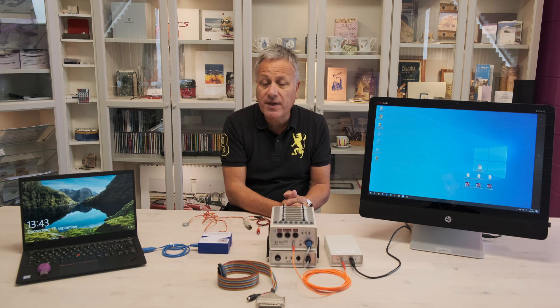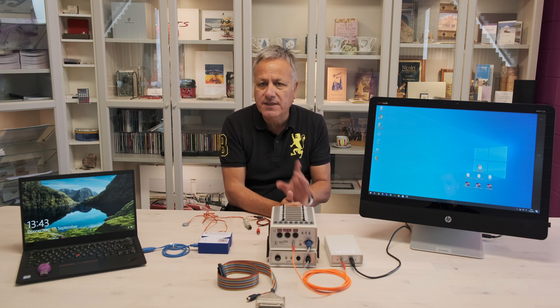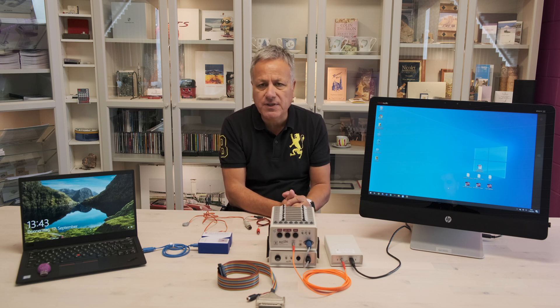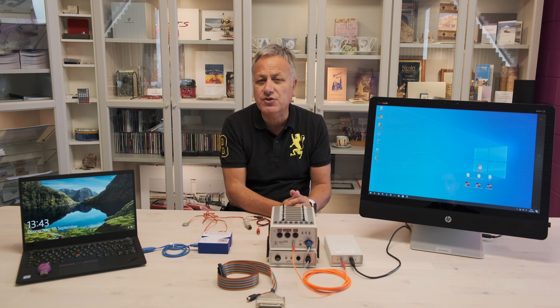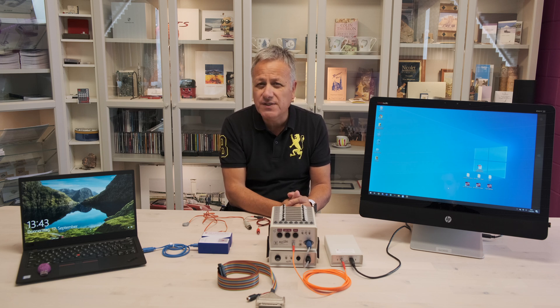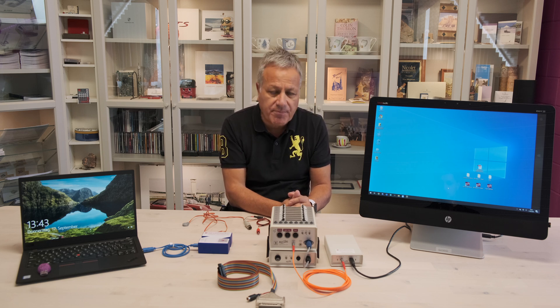Before we begin, a quick disclaimer. This setup is only used for demonstration purposes. For safety reasons, it must not be replicated.